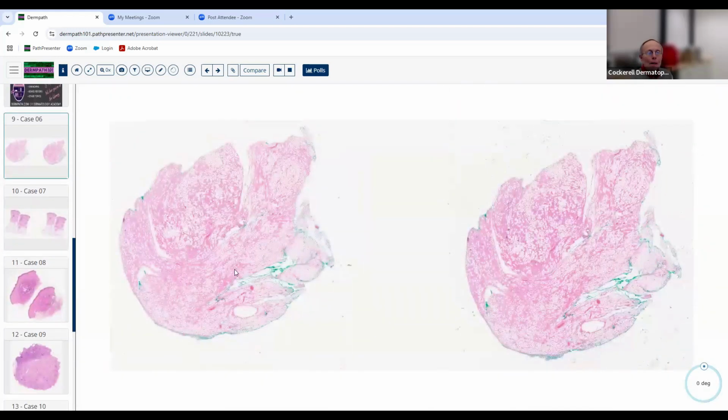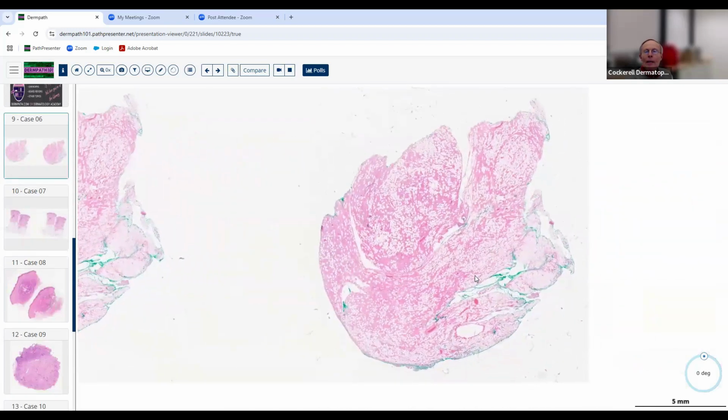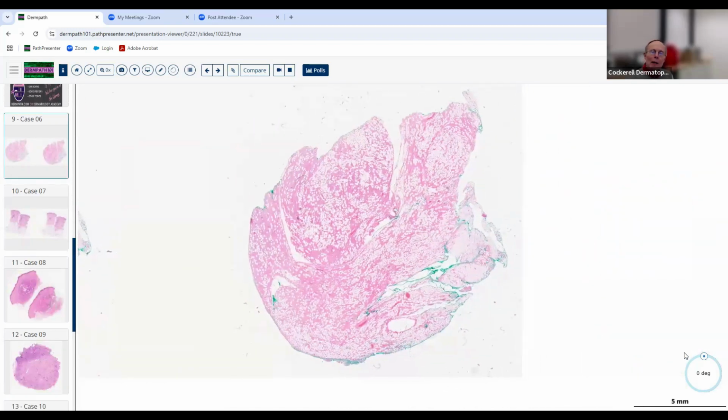Okay. Another neoplastic process here. And you look at this and you say, well, how was this biopsy taken? We've had punch biopsies, we've had shave biopsies, we've had an excisional biopsy. Well, now we've got the fourth type of biopsy that dermatologists take: punch, shave, excision, and then this procedure. And this is called an enucleation procedure.